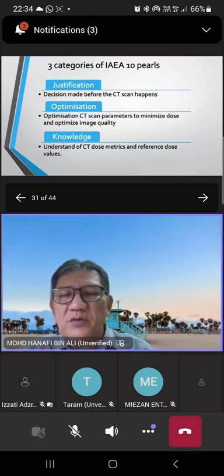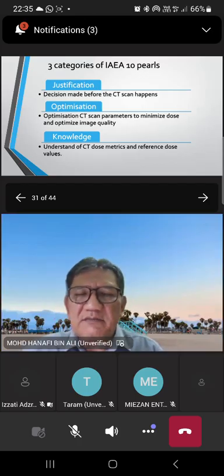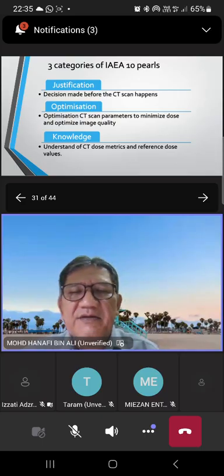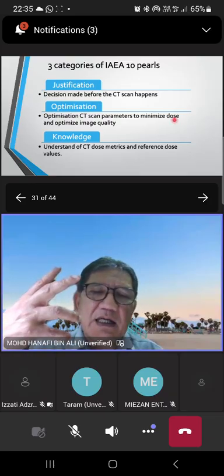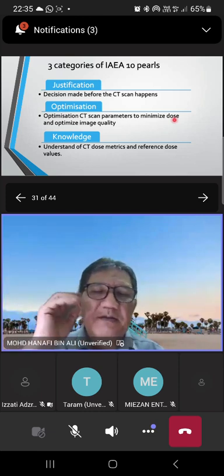Tapi kalau you kata isotop is different, okay? If you want to deal with radioisotope and X-ray, it's different. X-ray, when we press the button, it's X-ray on. When we release the button, it's off. We normally set the time. Paling lama lah X-ray dalam fluoroskopi. Kalau nak paling senang sekali nak bagi contoh, bila kita pergi dentist, dia ada X-ray, dia panggil OPG.